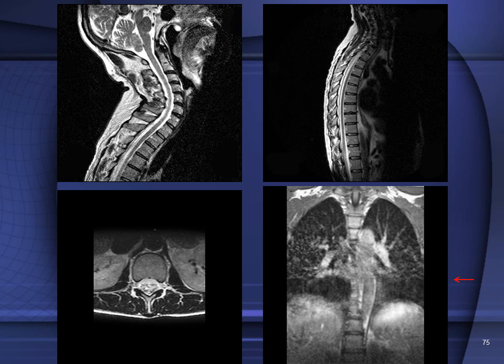And in the final panel, this is a coronal MRI scan of the thorax and upper abdomen. See the lung fields, some of the bronchi, the dome of the diaphragm over the stomach and spleen, and the dome of the diaphragm over the liver. And we see some intervertebral discs and vertebral bodies.